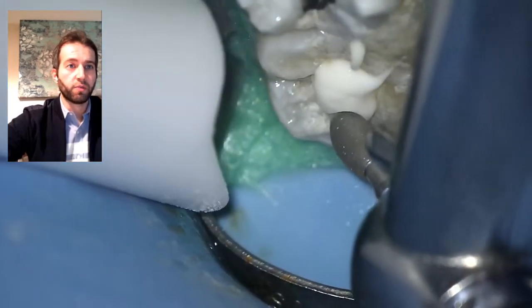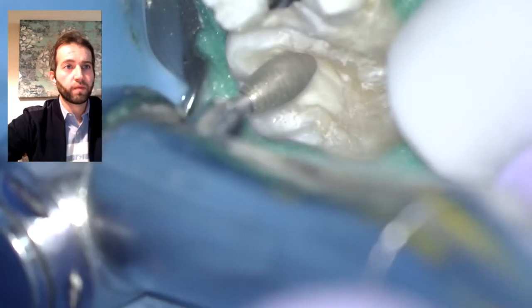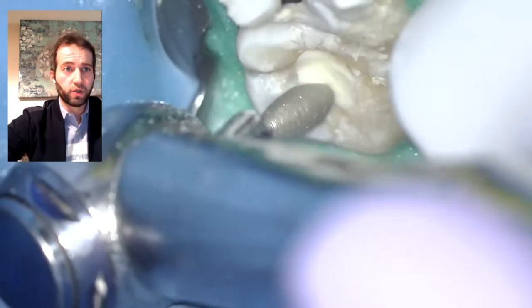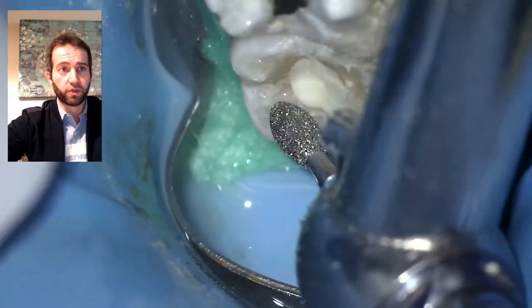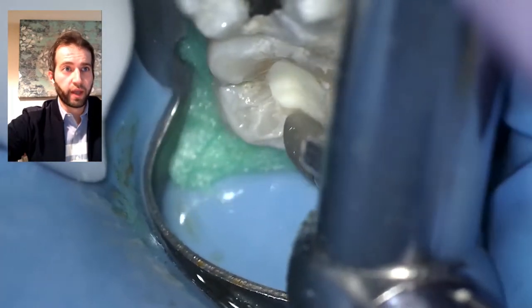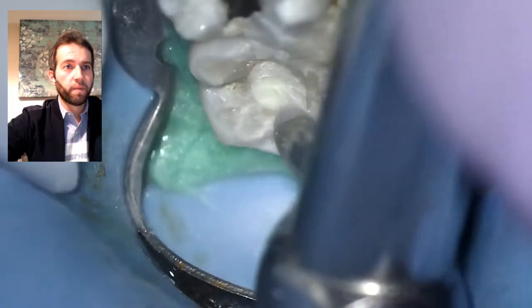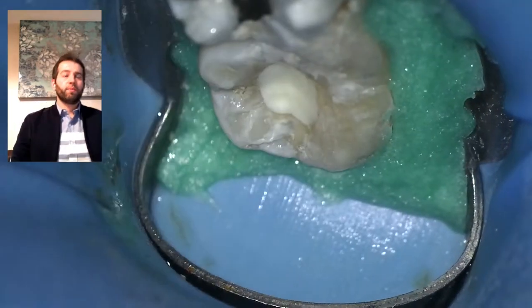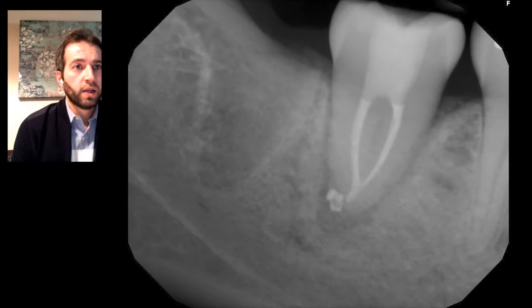After curing, we look at it and if there's any excess, we smooth it out with our burs. This tooth was adjusted out of occlusion at the first appointment, so it's not going to be hitting anything until it gets a full-coverage crown. I'm making sure the cavosurface margin is flush and removing excess buildup from the sides. Then we take the rubber dam off and expose our final radiograph to make sure everything is nice — treatment is done.